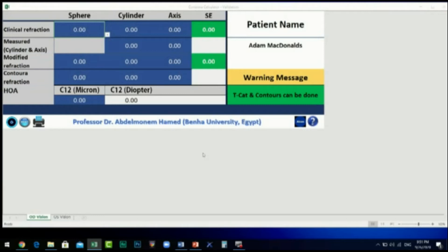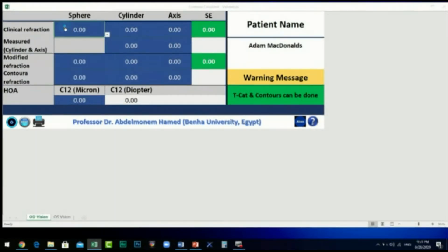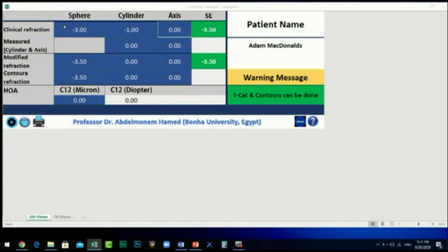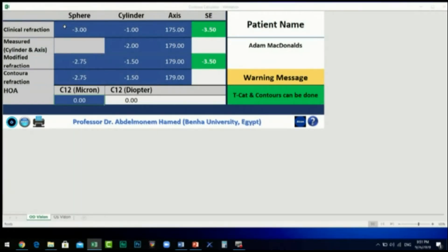In the first row, enter the clinical refraction of the patient — for example, minus 3.0, minus 1.0, axis 175. In the second row, enter the measured cylinder power and axis.